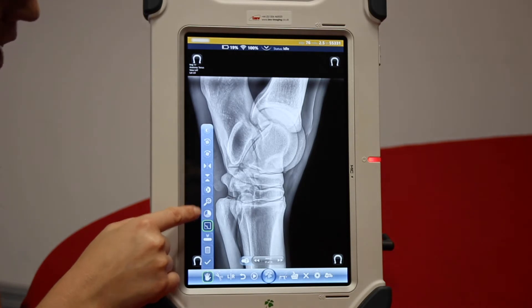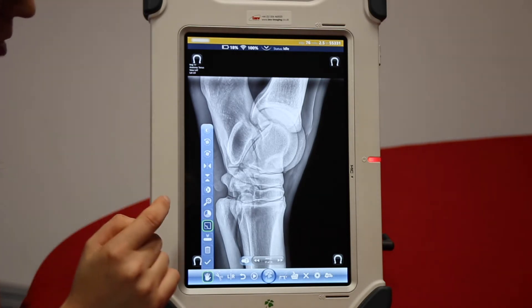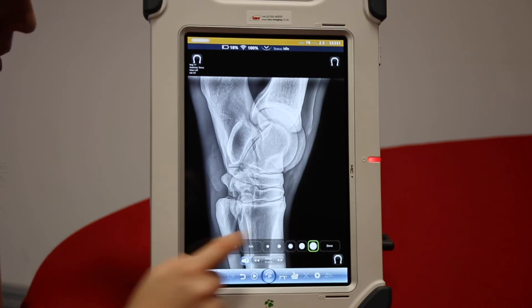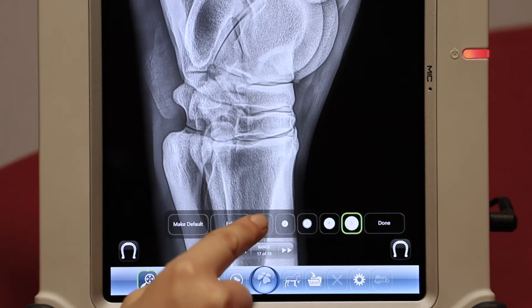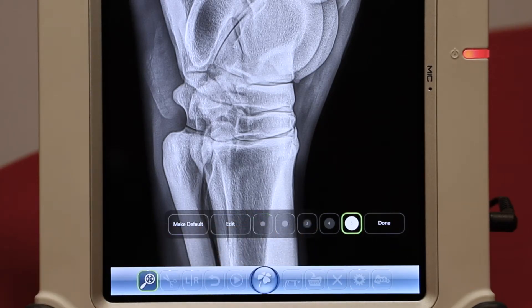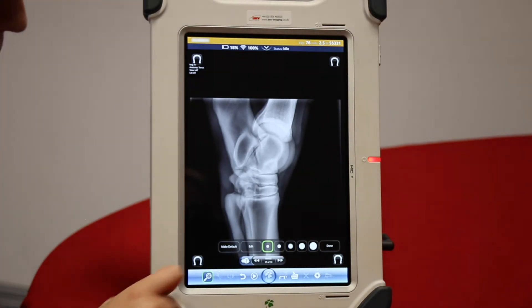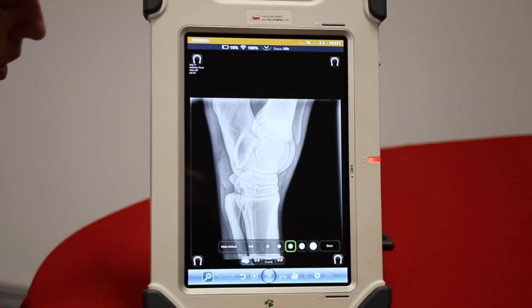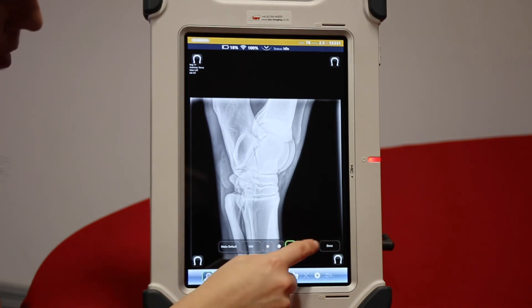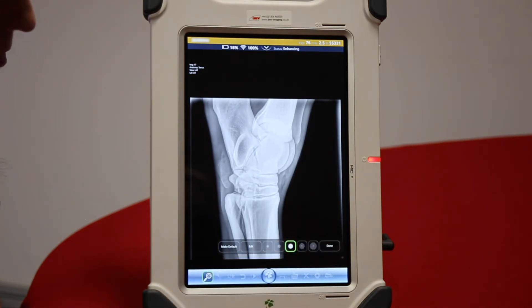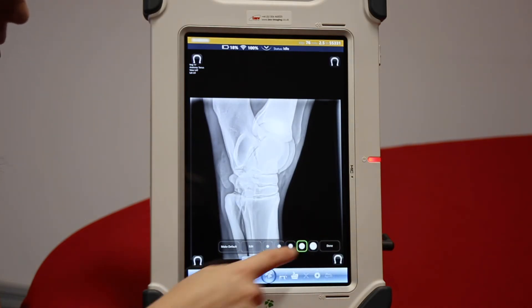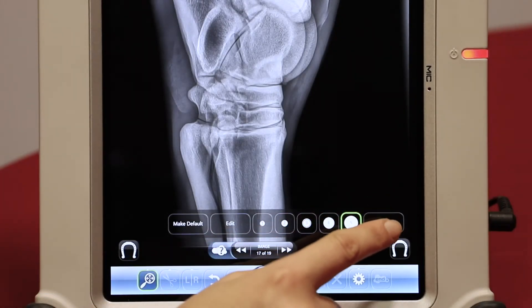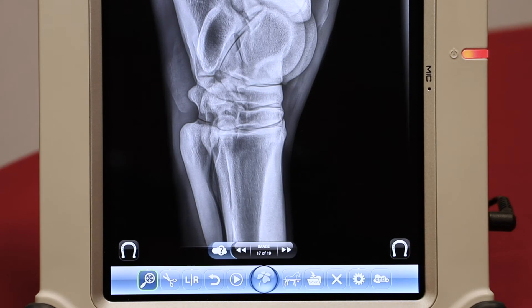Here we can apply different algorithms to the image and it will give the image a really different look. Currently it's on number 5. We can go to number 1 and see if that's something we'd prefer, or we can go to 3, or maybe 5. Just press Done when you're happy.